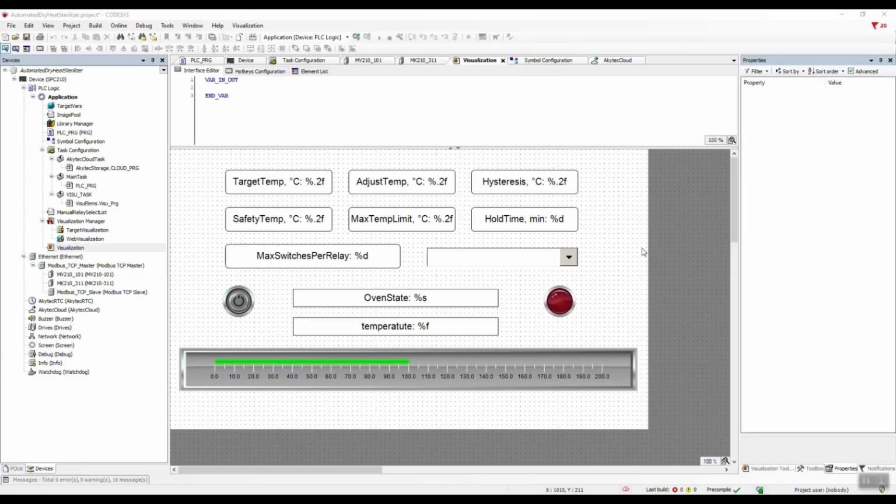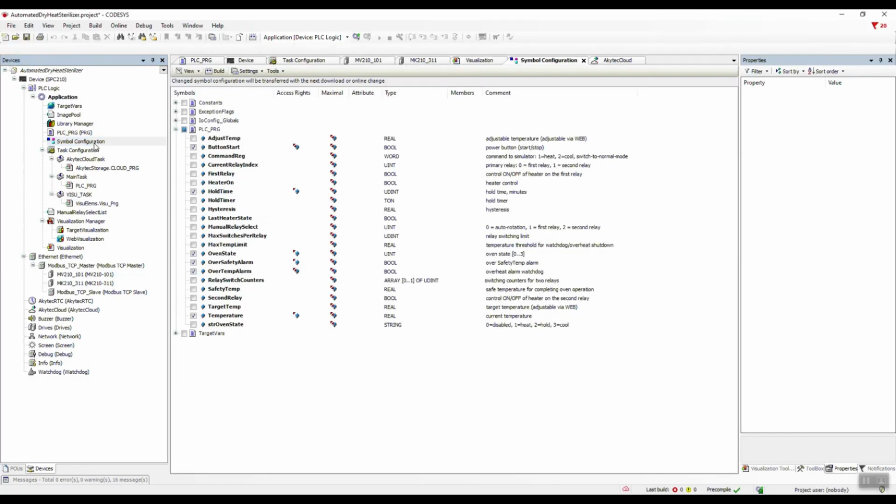Now, let's pass some of the variables up to the top level of the automation system, for example, to the cloud service of the German company akYtec. To do this, you'll need to add the symbol configuration component to the CODESYS project and check the boxes for the variables you want to export to the cloud service. For each of them, you can specify the access type, read and write, or read only.